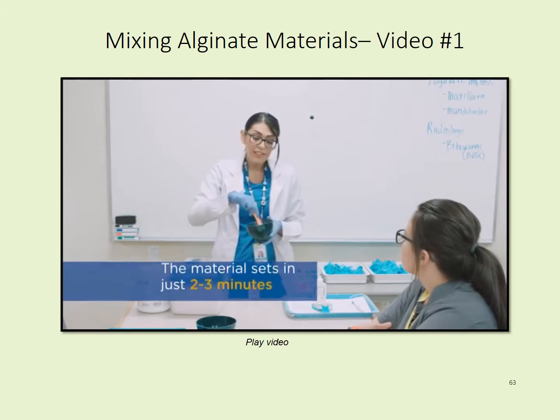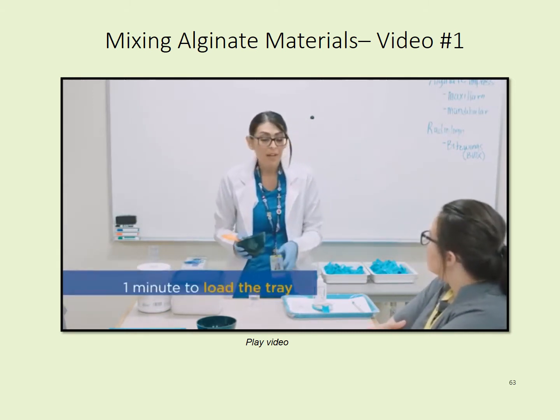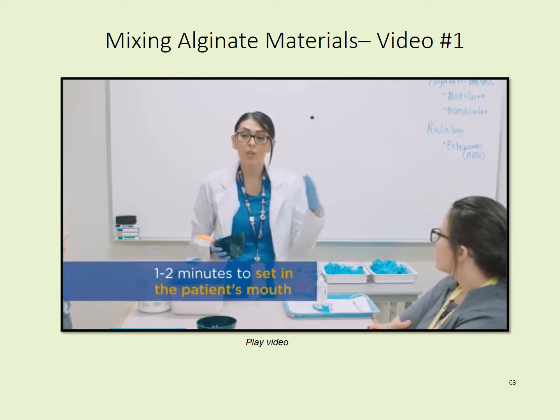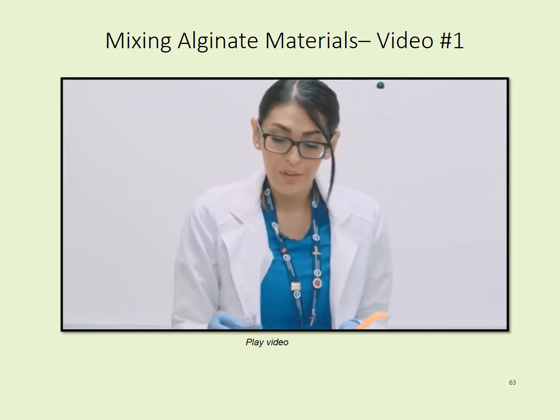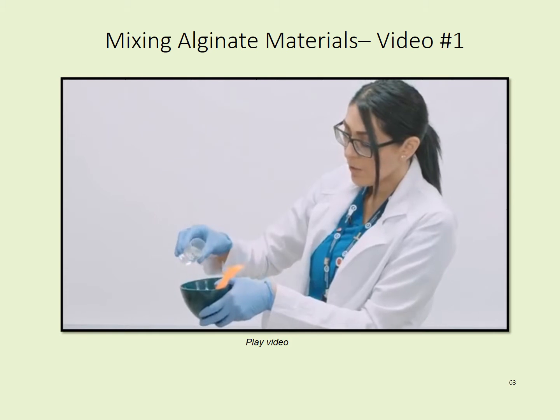Now there's a 30-second mixing time, and then there's about a 1-minute time to load the tray, and then an additional 1 to 2 minutes to set in the patient's mouth. What we're going to do is go ahead and start with our water and pour it in our mixing bowl. So we go ahead and pour like so.